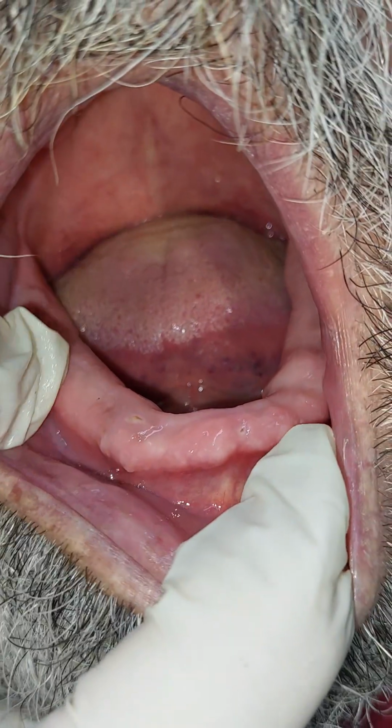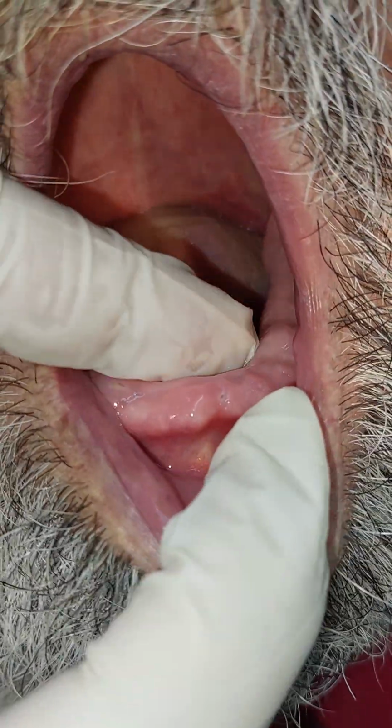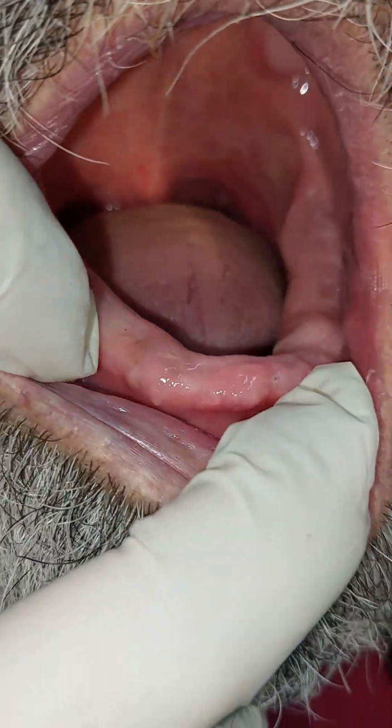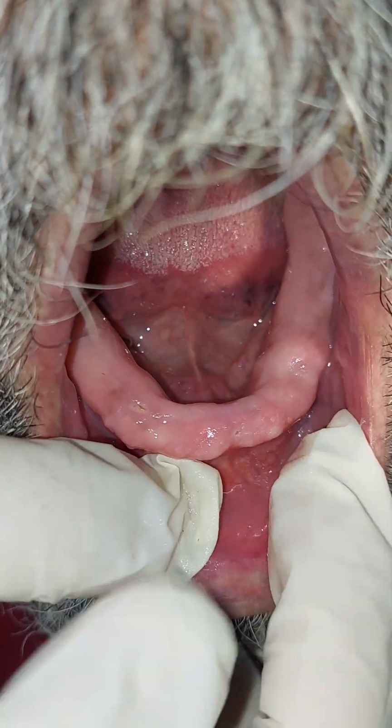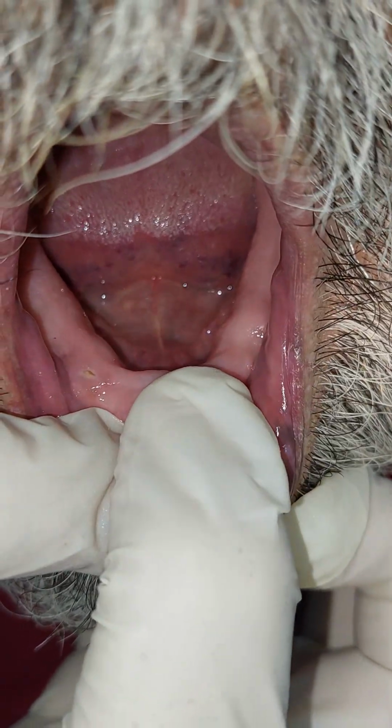We had a lot of undercuts today, so we're going to complete the demo around them. And this is another case of exostosis. Notice if I look from upwards, if you bring the camera from this side, you see that this is an undercut. See how my finger disappears in it when we look from the occlusal.